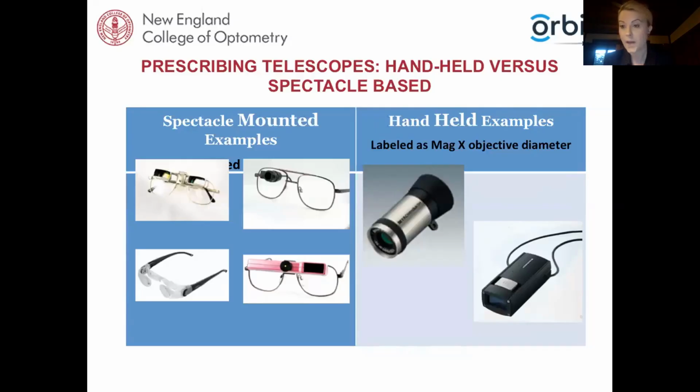Or you've picked the power that you need and you're really deciding between what is going to be more practical for the patient. So you're trying to decide between a hand magnifier versus a stand magnifier system, and glasses, which all have the same equivalent power, but you're trying to find out what's more convenient for the patient to use. So I think there is some training and some further evaluation that's often needed after your clinical assessment that a rehab therapist or a staff member can do beyond the exam room with the patient, or have the patient, as you say, take it home and try it.